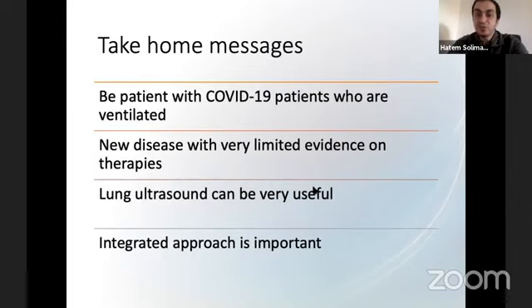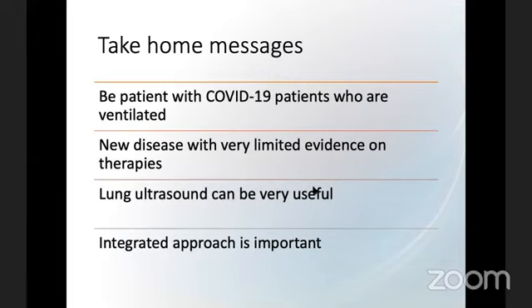If the patient works hard with the non-invasive ventilation, I think it's not a good idea to continue with NIV. Otherwise, they will have the self-inflicted lung injury that we discussed in the presentation. But if NIV succeeds in offloading the respiratory pattern and improving the breathing condition, I strongly recommend NIV. Okay, I think it's clear now.